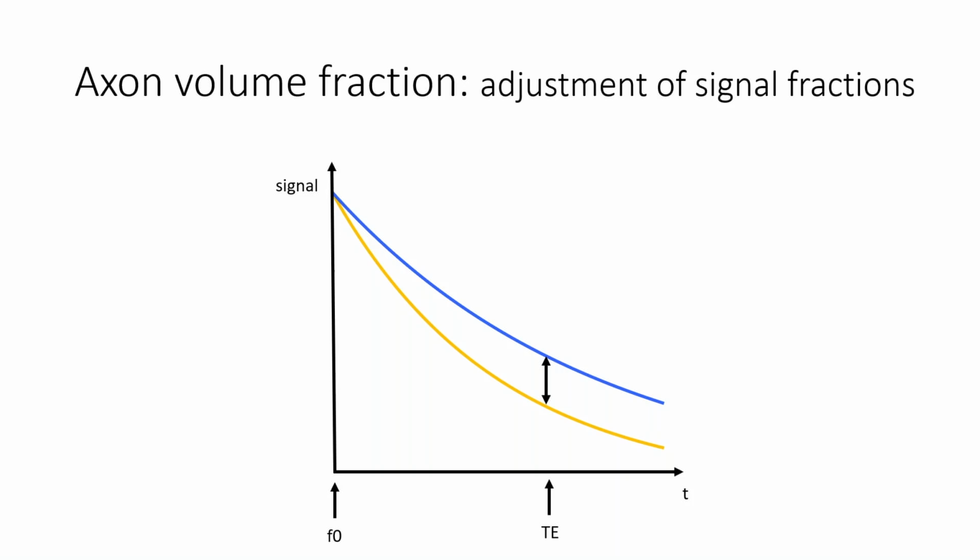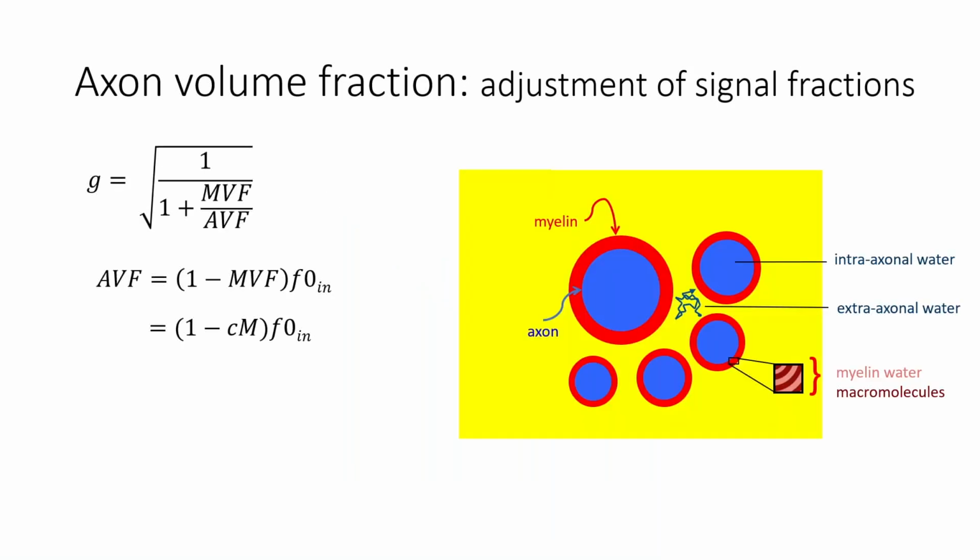If there is spatial variability, then this mapping will not be a scaling, and you can end up in a scenario where a certain region has a truly elevated G-ratio compared to another region, but it appears to be decreased. That's because the difference in the volume fractions is changing. So we need to take T2 into account.